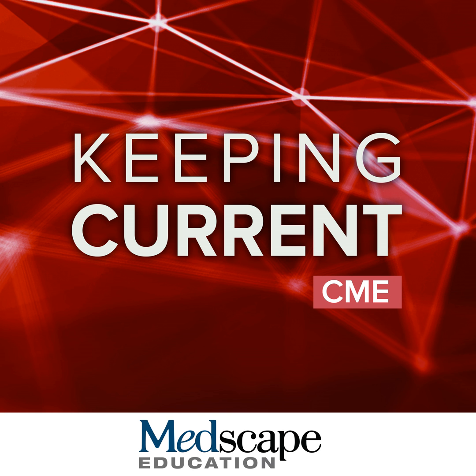ARIA, in our imaging findings, most commonly occurs without any clinical symptoms. If clinical symptoms do occur, they're generally mild and non-specific. There have been infrequent severe symptomatic cases that may require hospitalization and close monitoring. And there have been rare recorded fatal outcomes, a few of these including cases where patients on an amyloid targeting therapy presented with stroke-like symptoms and received thrombolysis.